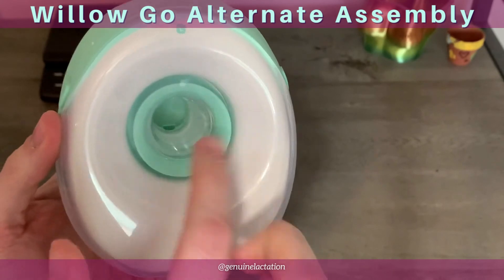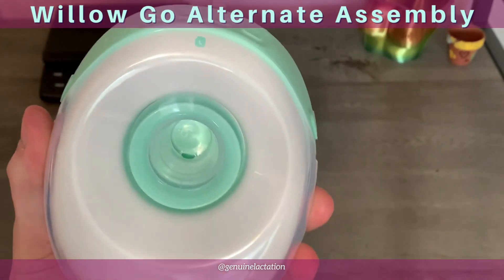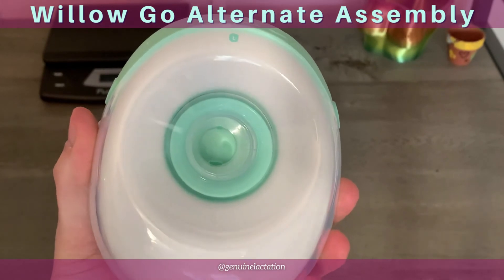Once everything is assembled, then apply your insert, because we can see all the different issues more clearly. Once you put an insert in here, unless it's clear, it's going to cause problems.